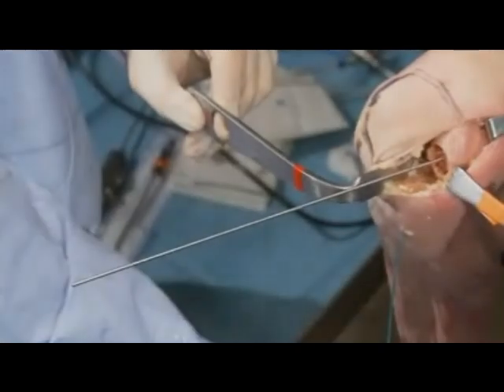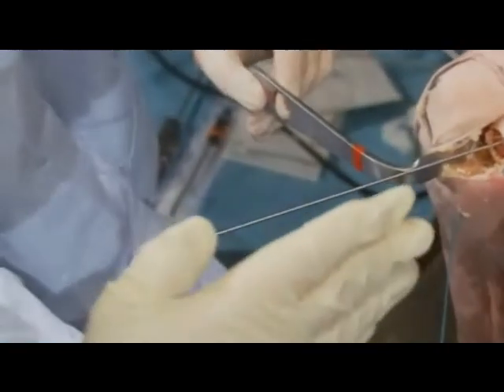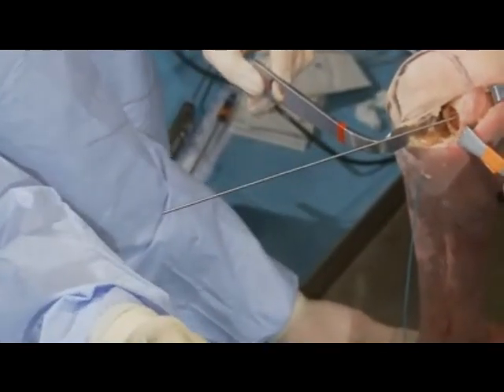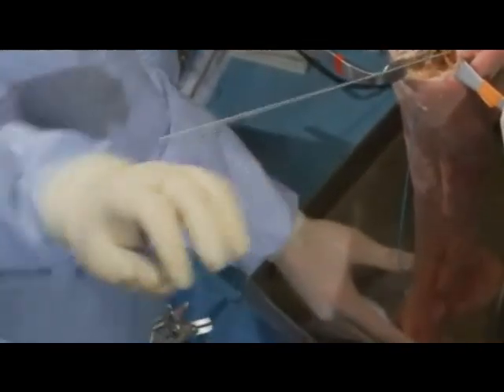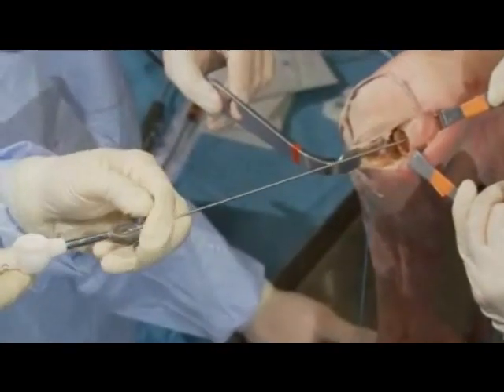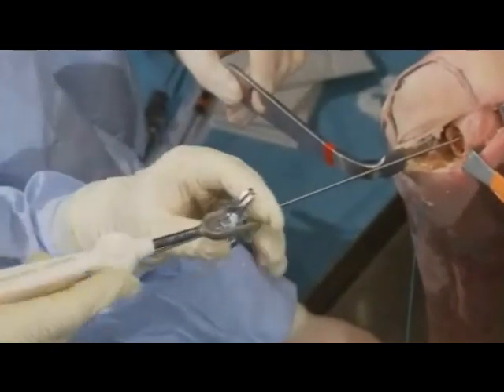We have a second device here, and these are all calibrated. So this is a 7 curvature that we're going to put in here. And again, this is independent. So this is going to go in the circle, and this is going to go on the 2 tips of the femoral condyle to insert our next 2 pins that are going to allow us to ream in an anterior posterior.